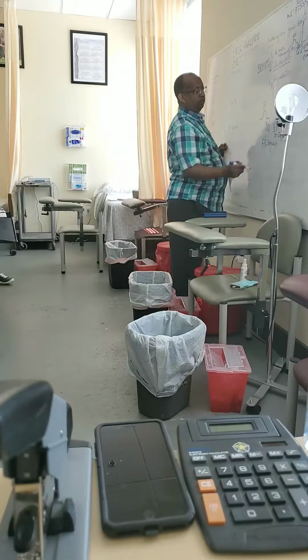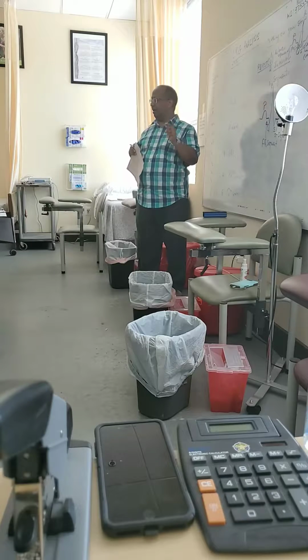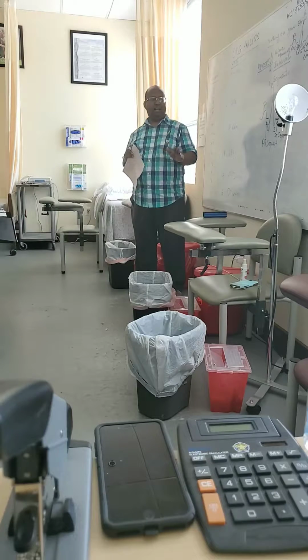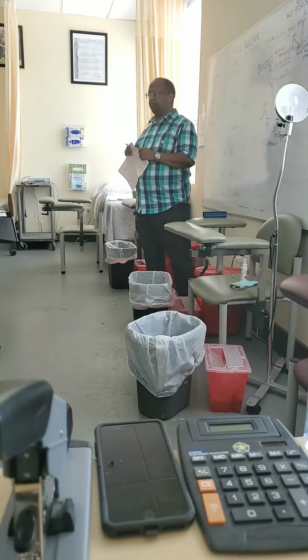So these are the segments that we have. How many waves do we have? Five: P, Q, R, S, T. How many segments do we have? PR and ST segment. What happened with the Q?